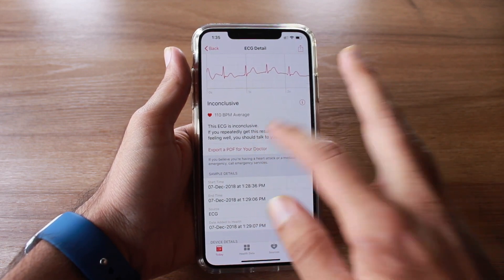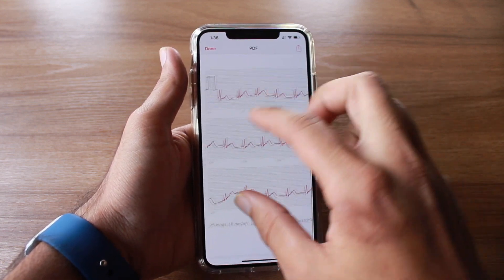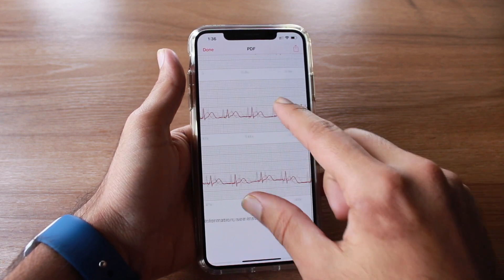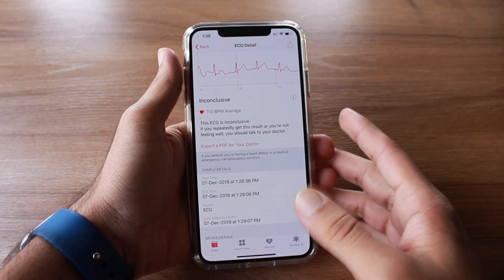The good thing is that you can export a PDF for your doctor. It shows the patient's name, date of birth, heart rate, and very detailed graphs. This is really helpful for a doctor to consult and check what's wrong with your heart rate.